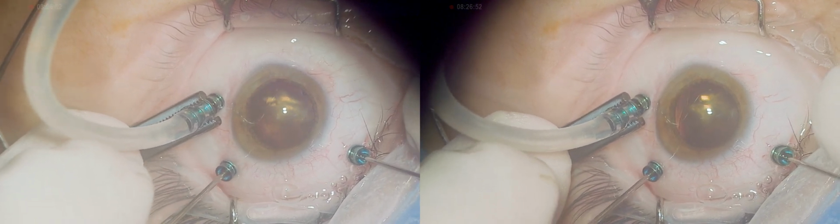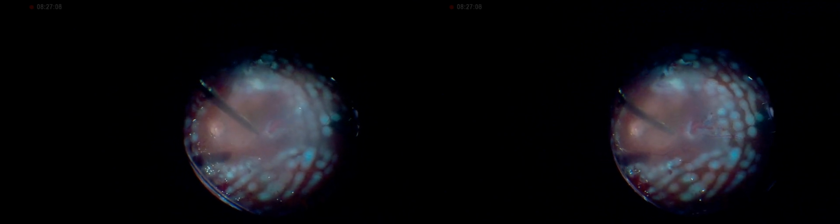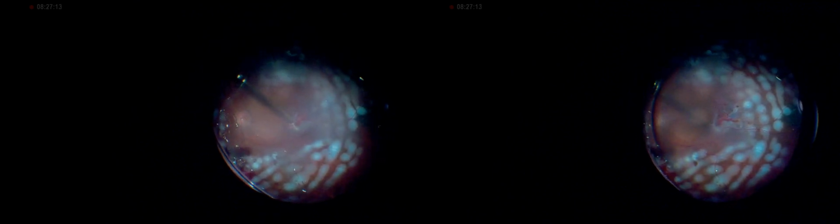Time now for a direct exchange of perfluorocarbon liquid for silicone oil. Notice the lens is kept clear during the whole procedure. A complete fill is reached and all PFC removed. Macula looks pretty flat with no tractions and free of epiretinal tissue or fibrosis.